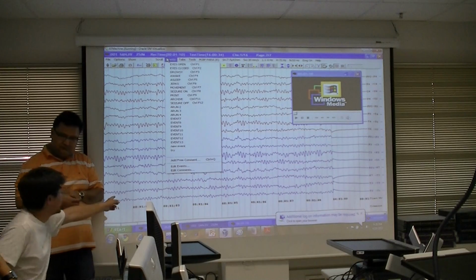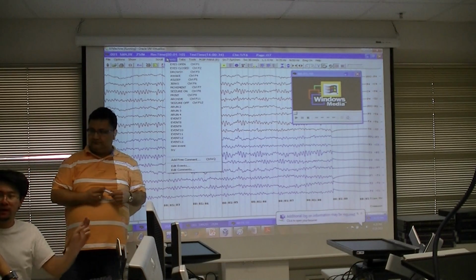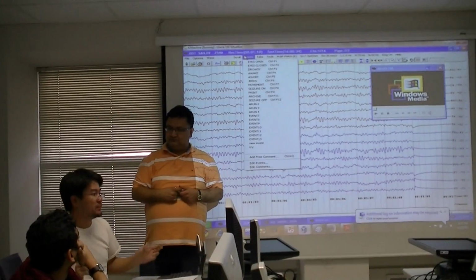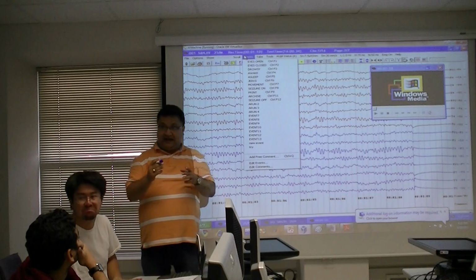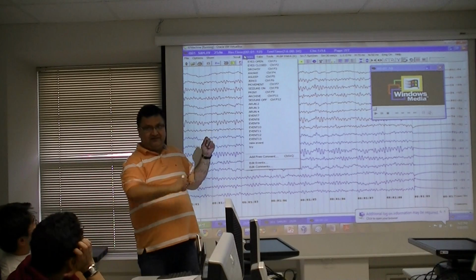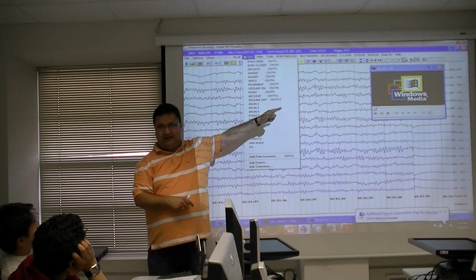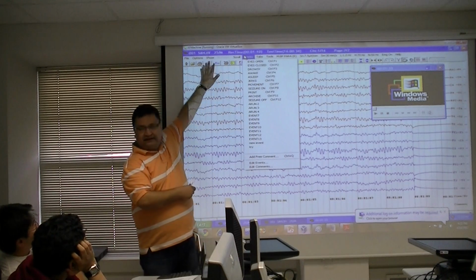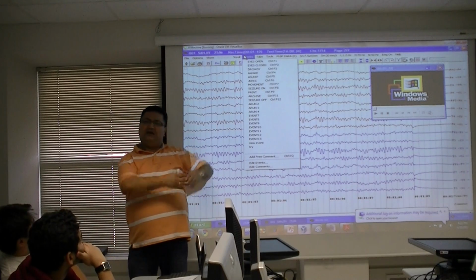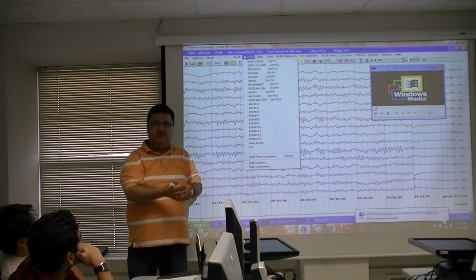Each channel you can consider as one feature. You have a feature vector of 30 or something. Yeah, you are right. Even I can take the data individually from here. If I select channel 1 or channel 2, if I select the channel by name, one channel I can get the data individually. But initially I'm trying to do it with the 16 channels all together, but slowly I can go forward and back.